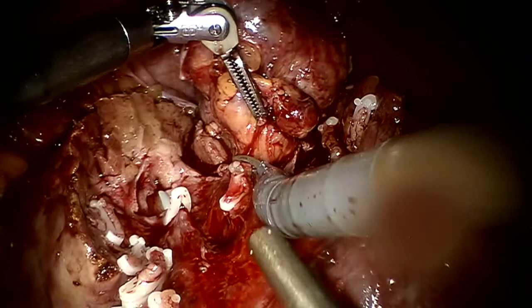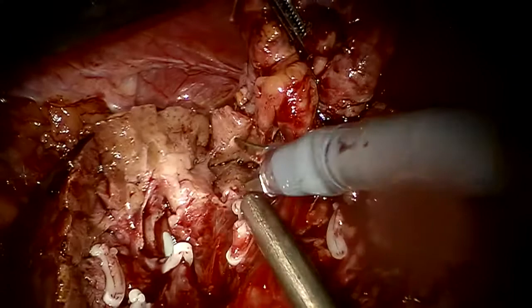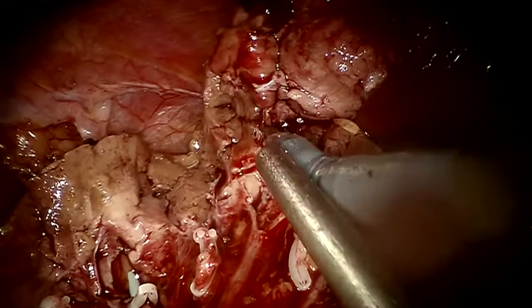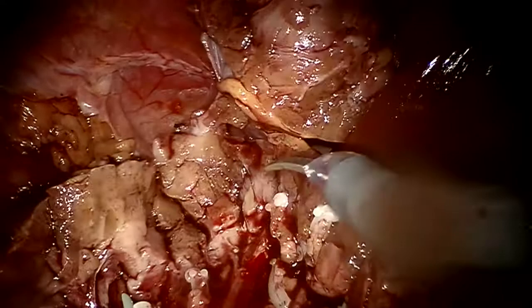But you have no alternative, yeah, to get this tumor out. So I'm comfortable with the margins. Vascularity is a whole different story. Bag? Yeah. Here is the thrombus. Yeah. Here is the thrombus.